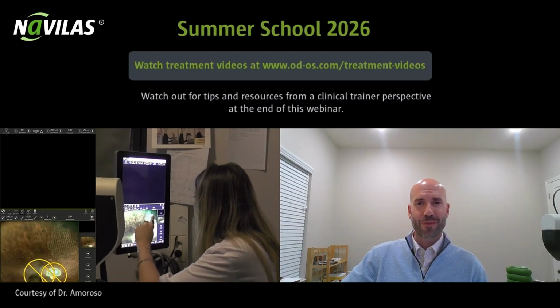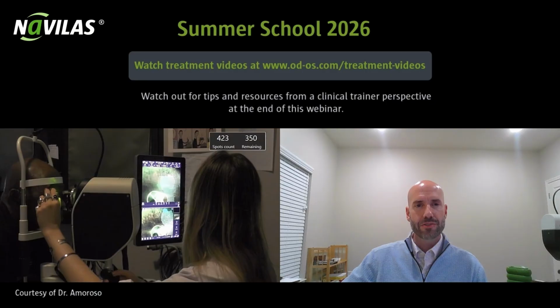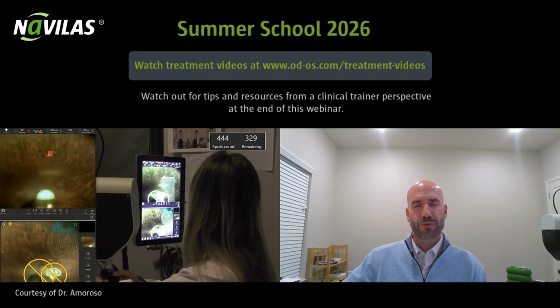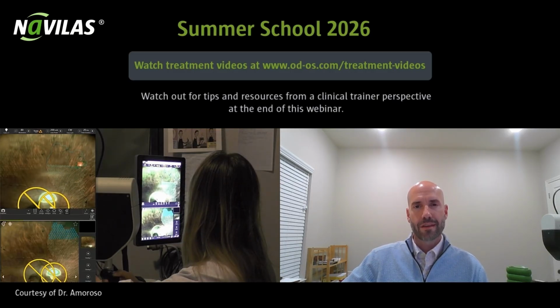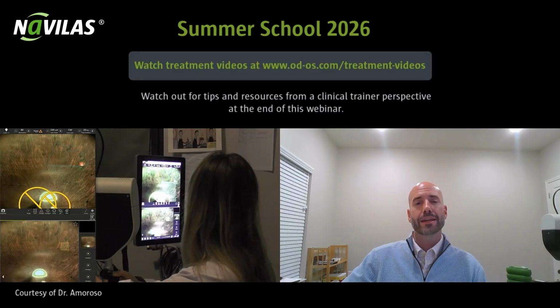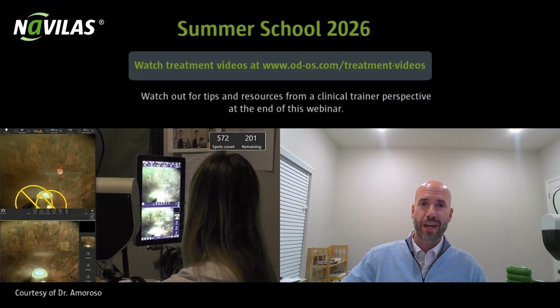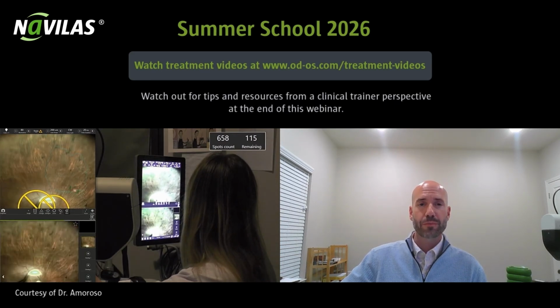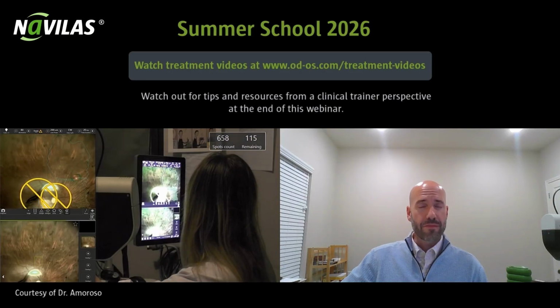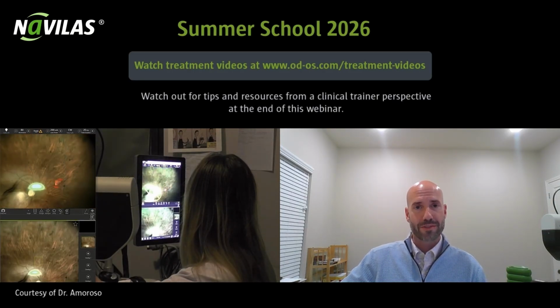Thank you for joining us for this session of our summer webinar series, in which we seek to advance knowledge and skills in ophthalmology through Navilas, our novel navigated approach to retina laser, which employs an on-screen digital camera interface, import and overlay of third-party diagnostic images, and active eye tracking to assist physicians in creating semi-automated laser treatment plans for the full spectrum of treatable retina pathologies. The features of Navilas have also made it an indispensable educational tool for doctors in training.